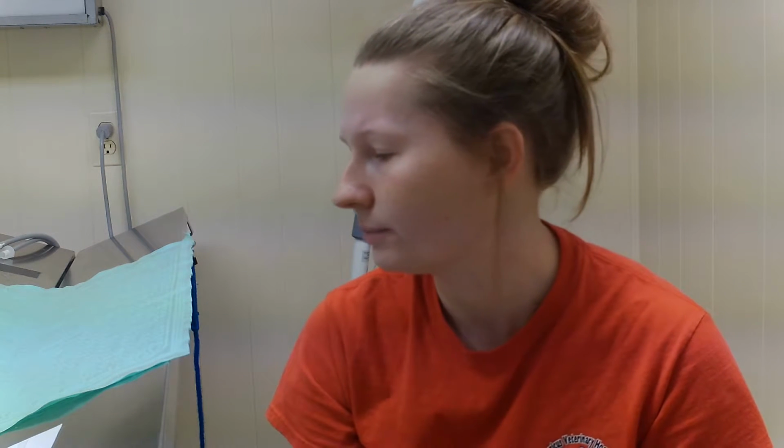Plus, you really don't want to stick your dirty fingers into a patient's eye, gloved even. I wouldn't even put a sterile gloved hand or finger onto the globe of an eye, because I don't want to damage the eye in any way, even if it is sterile, even if it is gloved. Just don't do it. Unless you're euthanizing, then it really doesn't matter.